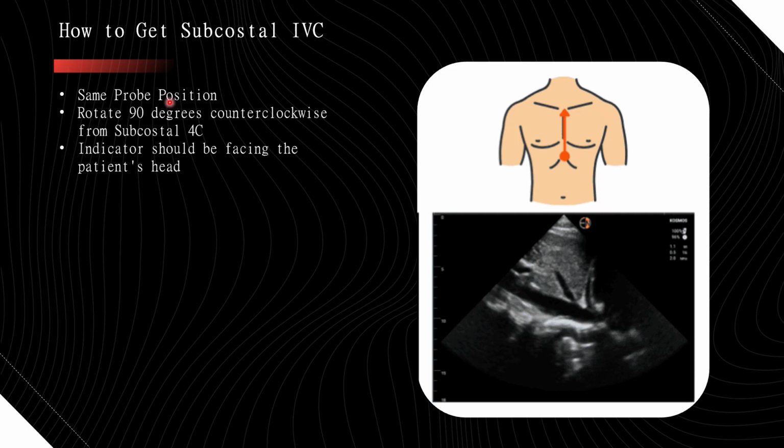How to get subcostal inferior vena cava. This is the same probe position. We just rotate 90 degrees counterclockwise from subcostal four-chamber. The indicator should be facing the patient's head now.